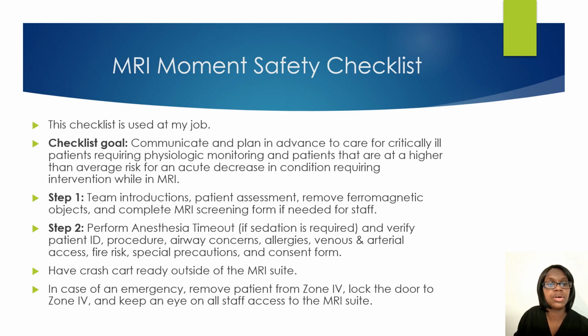This is when you are going to communicate with everyone in the MRI suite, especially if you are getting ready for a biopsy or a case where a patient has to be sedated. You want to make sure that you are performing a timeout where everyone introduces themselves. The patient completes the MRI screening form and you review it with the patient. Make sure all metal objects are removed from the patient and other medical staff.